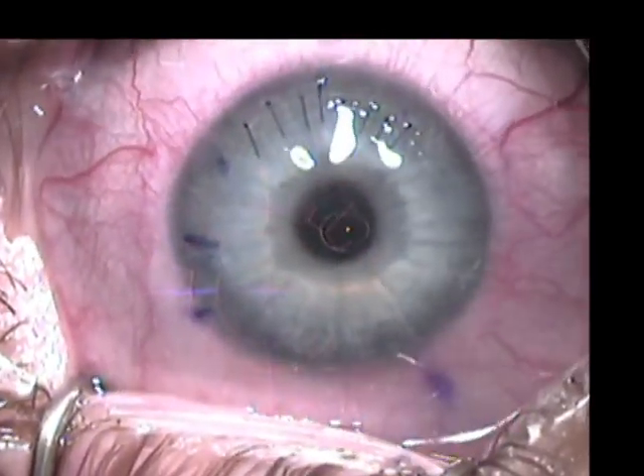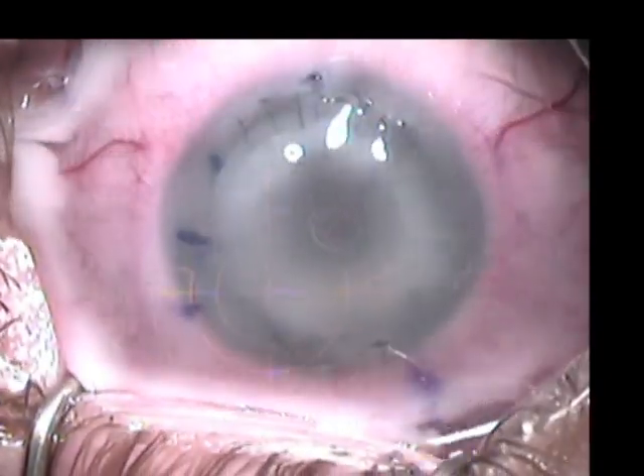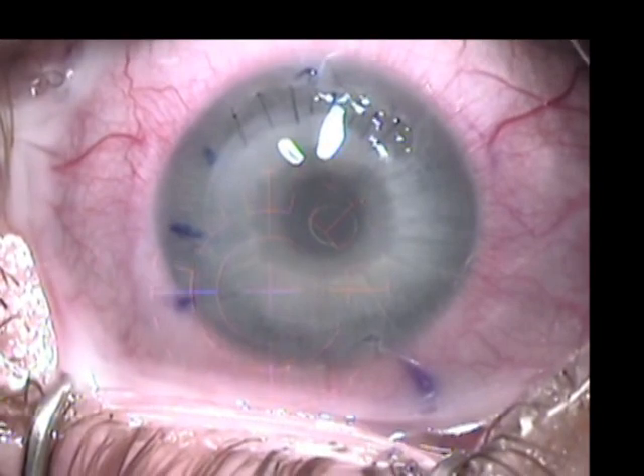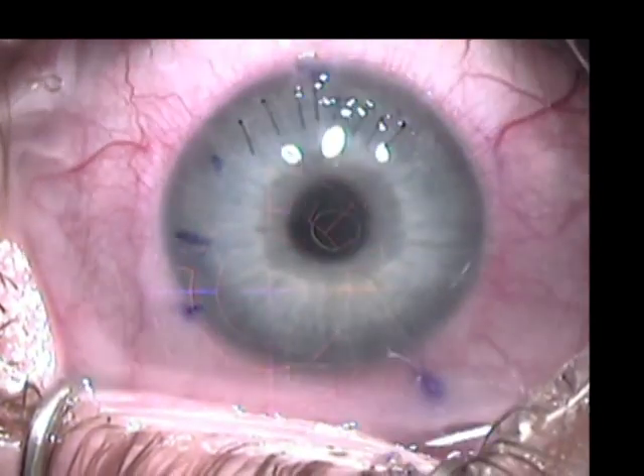Drops of Acular, Zymar, and Pred Forte are placed on the surface of the eye, and after a soft contact lens is placed, the case is concluded.